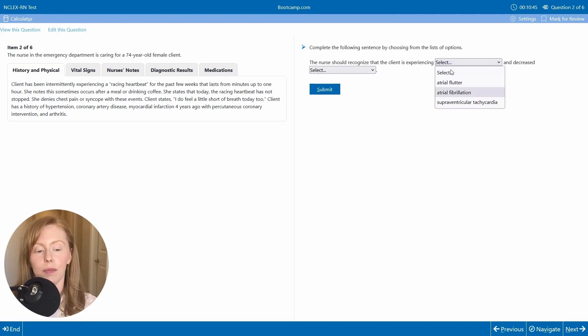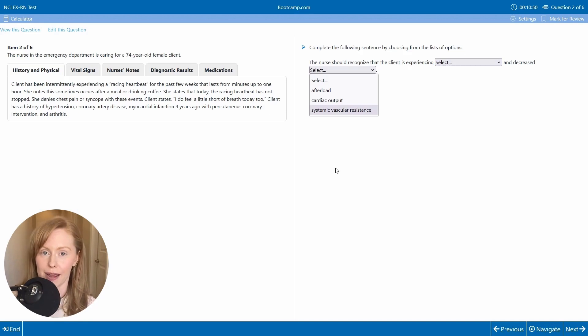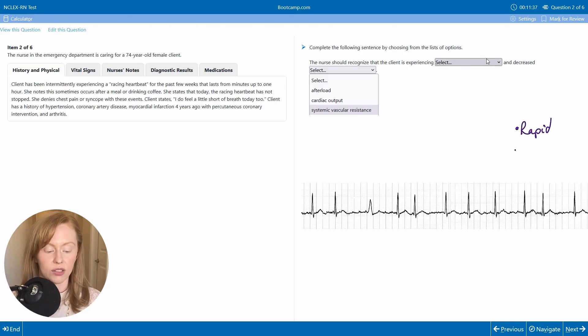So let's first start by interpreting our rhythm and then considering what hemodynamic problems that could create. This is rapid and it is also irregular.